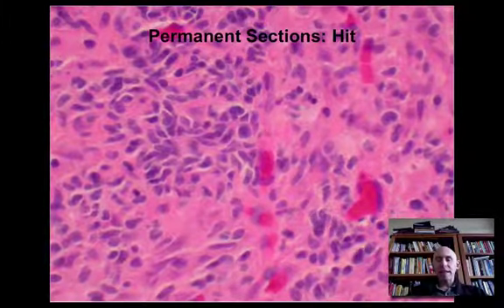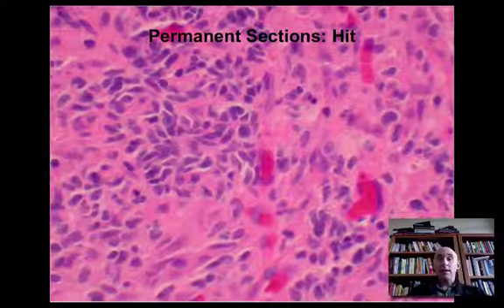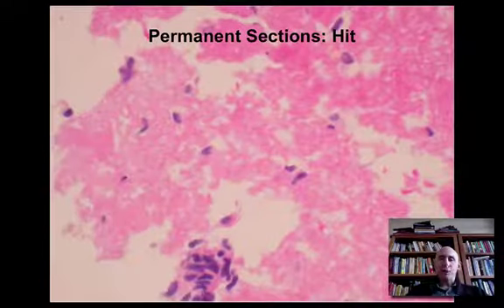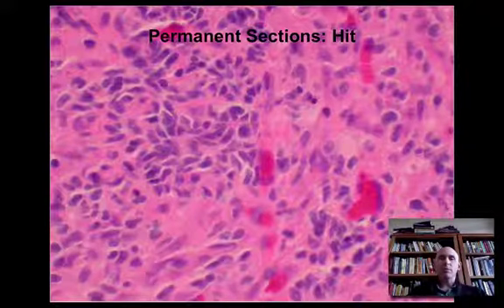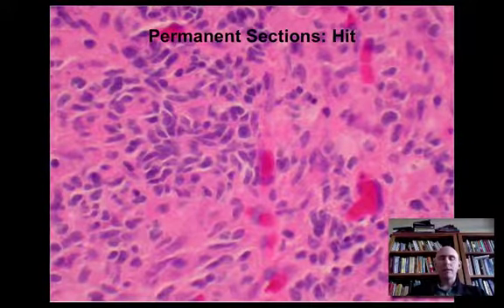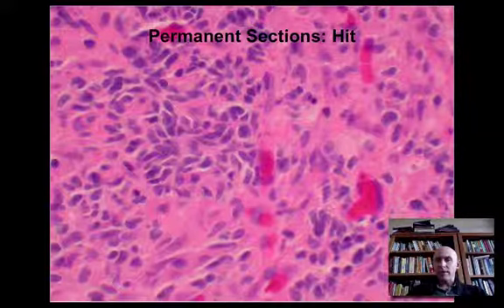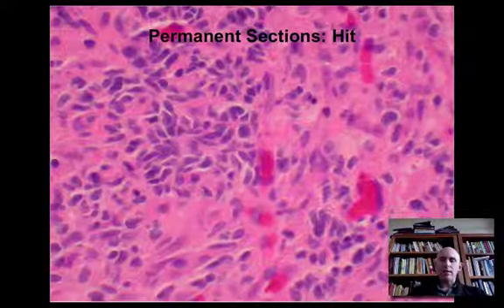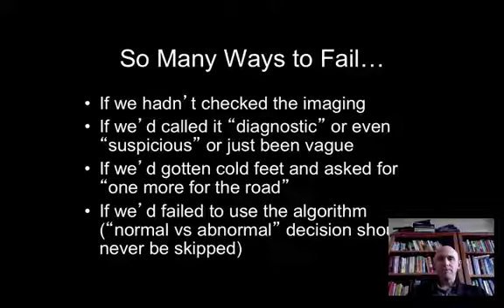And then we finally had enough material in cytologic preparation in the 5th sample to be comfortable saying, yes, this is neoplastic and astrocytic. Not a lot to go on, but in the presence of necrosis in the permanent section, we're on comfortable ground saying this is glioblastoma. This astrocytic neoplasm that's infiltrating radiographically with necrosis and this degree of atypia is perfectly satisfying as a diagnosis of glioblastoma.